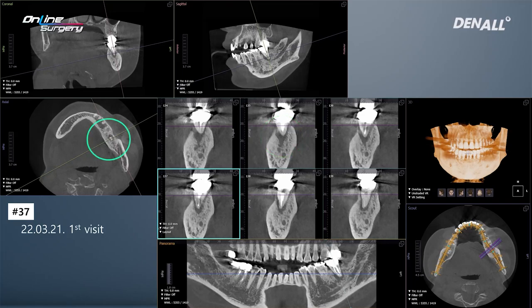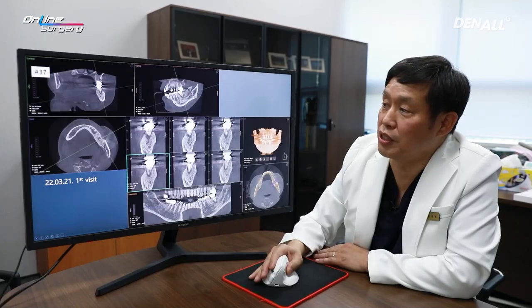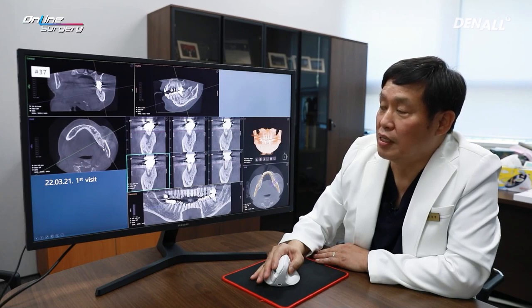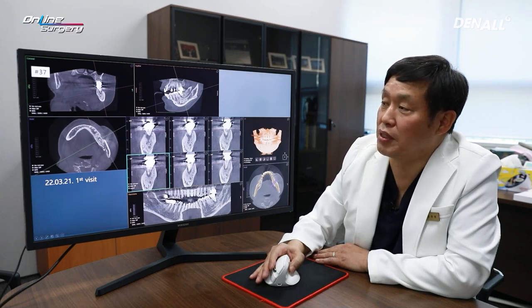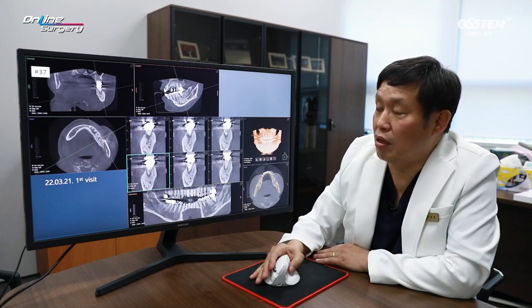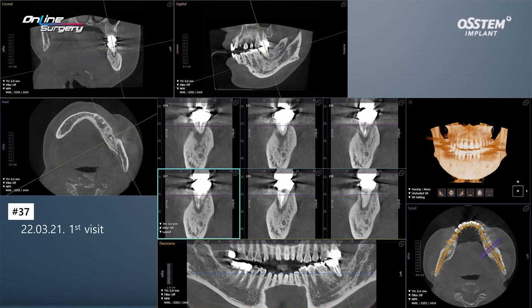If you look on CT, compared with mesial to number 37, the medullary portion shows a sclerotic change. When there's a periapical lesion and spread of inflammation due to the defensive response of the host, you can see that the surrounding bone is more hardened. Such sclerotic changes are not a major hurdle in placing an implant.